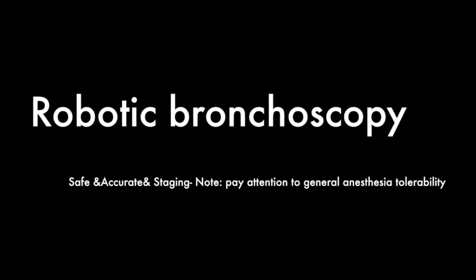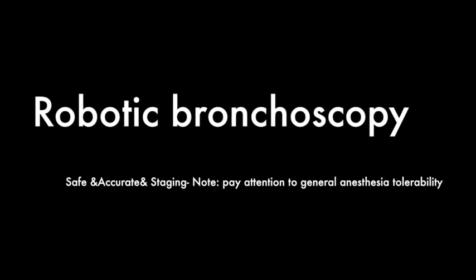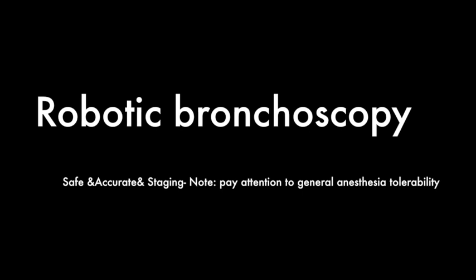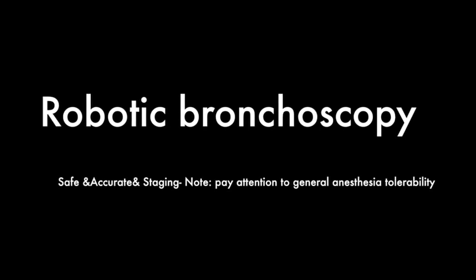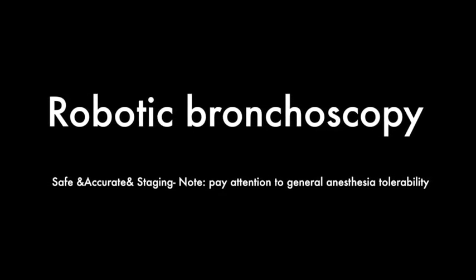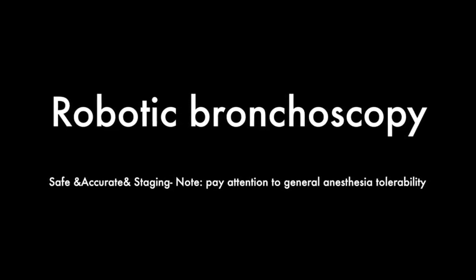In short, robotic bronchoscopy is a very safe and effective method to biopsy peripheral lung nodules, with the very good benefit of combining staging EBUS in the procedure as well, in order to treat the patient appropriately. However, one drawback we have to be careful about is that robotic bronchoscopy requires general anesthesia.